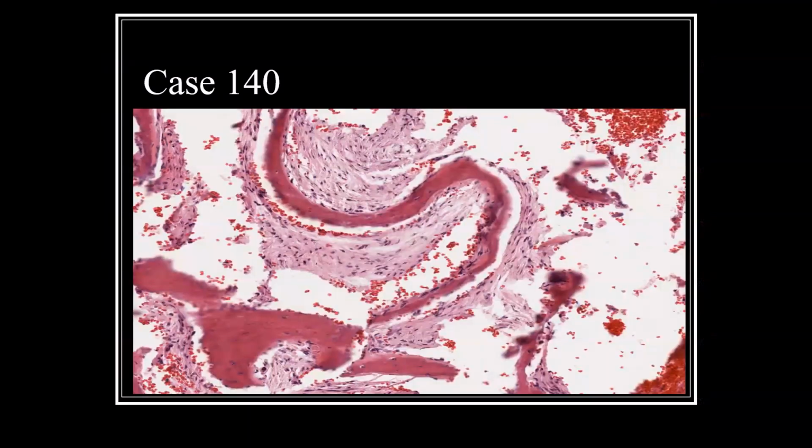Here's another example, going back to that earlier fibrous dysplasia lesion. You see the nice curvilinear bone formation without a lot of osteoblastic rimming. So it's forming out of a woven bone type of pattern. And although this is not a Chinese letter that Dr. Fung or any of the other of our colleagues could recognize.